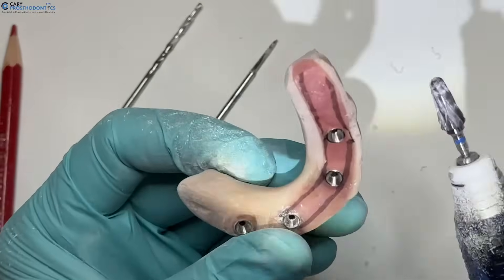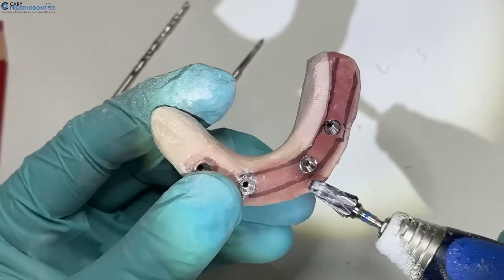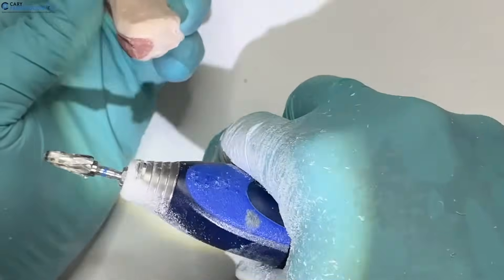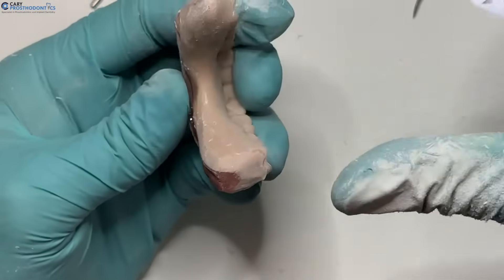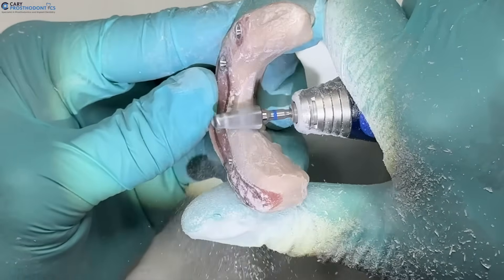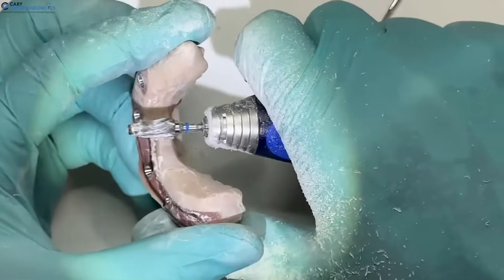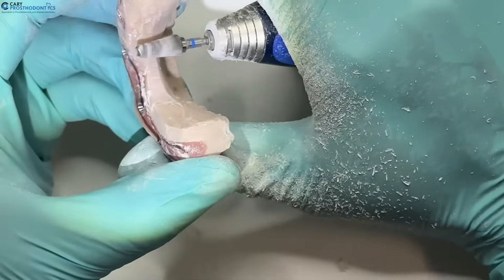With this drill I've taken off material vertically — you can see my lines are still there. We can also debulk on the lingual side so it's not so thick. I like to do this contouring with the screw access hole visible so I can thin in this direction while paying attention to where the screw access will be.